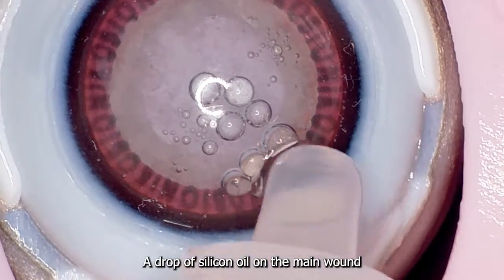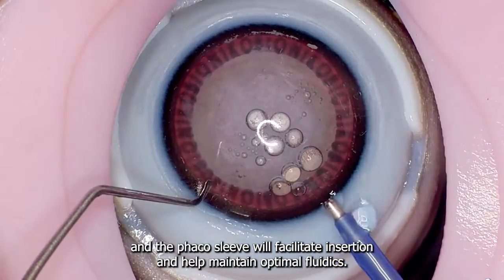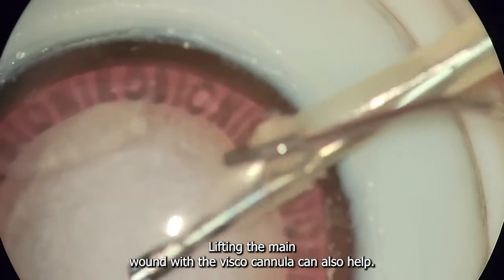A drop of silicon oil on the main wound and the phaco sleeve will facilitate insertion and help maintain optimal fluidics. Lifting the main wound with the visco cannula can also help.